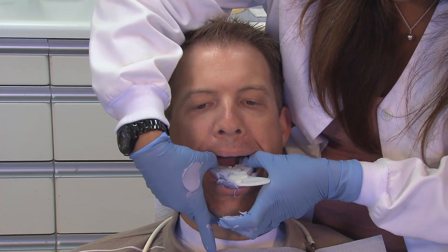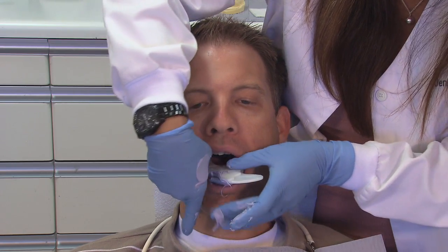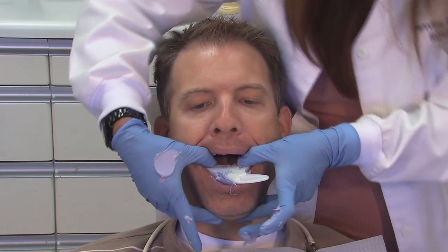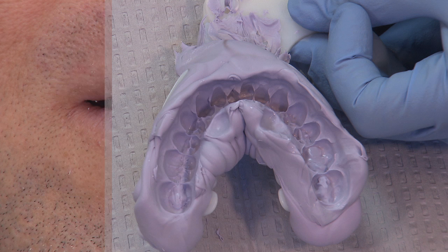So she's putting in the lower appliance now, clearing the patient's lip, having him raise his tongue to make sure that's not caught underneath there. And about 60 seconds later, you can see we've got a nice impression there as well. And basically, those are just cheaper polyvinyl impression material.